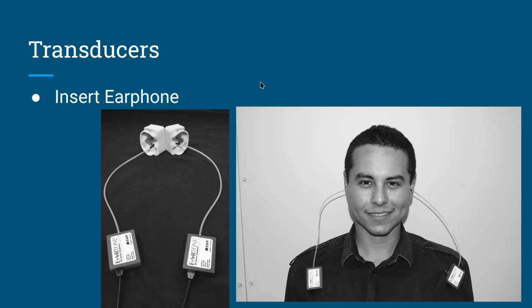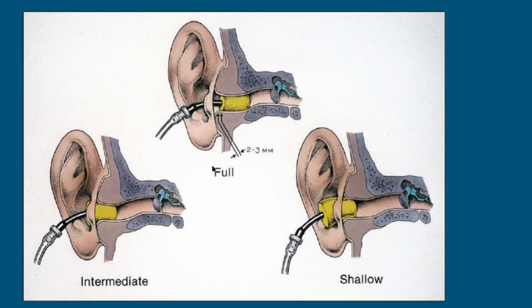The electroacoustic diaphragms are housed in a small plastic casing that you place on the shoulder, and the tubing connects to a foam insert, conformed to the ear canal with your fingertips and inserted into the ear canal like a foam earplug. So the inserts are disposable for hygienic reasons, obviously. Here's a picture of the different degrees of insertion.